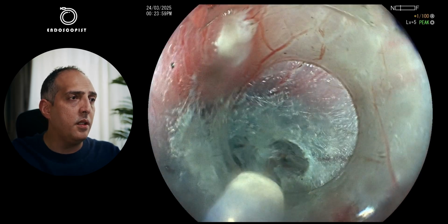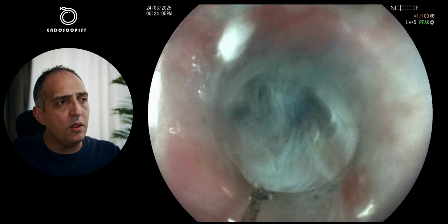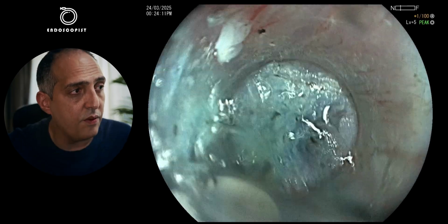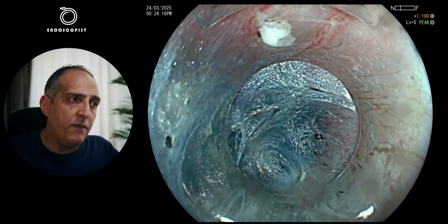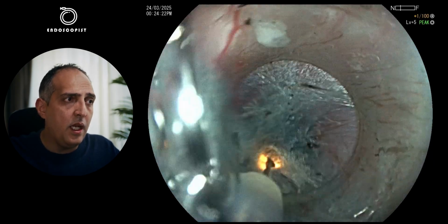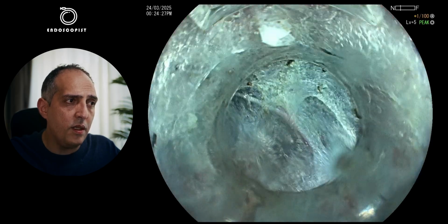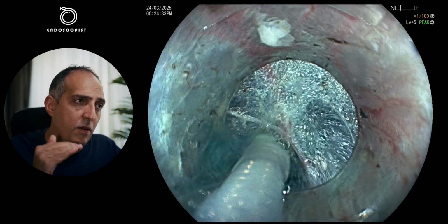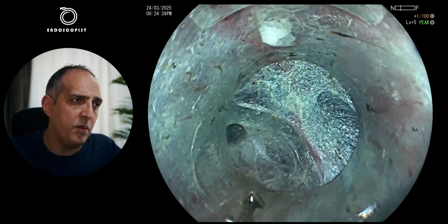And we are starting to see the sling fibers. There are some studies that suggest sparing the sling muscle fibers to decrease the incidence and the severity of reflux after the POEM technique. I believe you don't have to do it, but if you can spare the sling fibers, of course, you go for that. And one of the main landmarks for the sling muscle fibers will be the two penetrating vessels, which you find immediately at the level of the cardia. When you reach the sling fibers, they are above each other with about 1 to 2 centimeters distance.